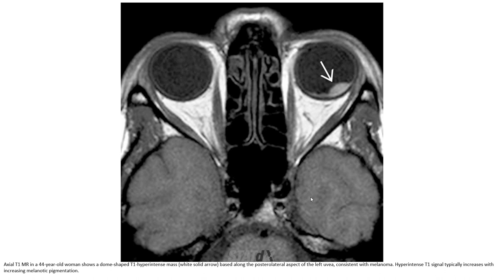Let's see this first case. On the axial T1 MRI in a 44-year-old woman, a dome-shaped T1 hyperintense mass is seen along the posterior lateral aspect of the left uvea, consistent with melanoma. The high T1 signal intensity corresponds to increased melanocytic pigmentation.